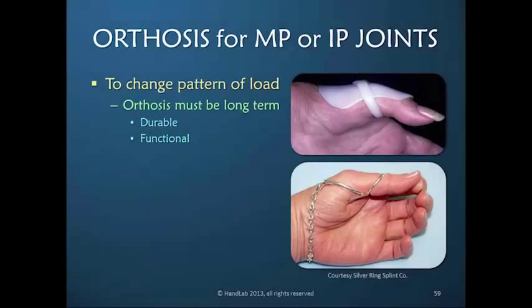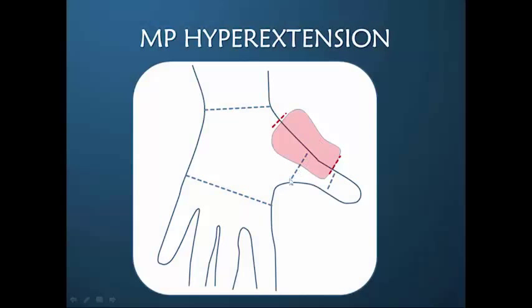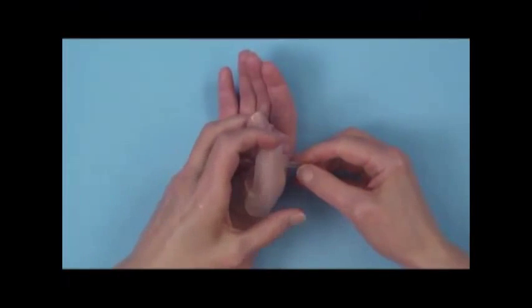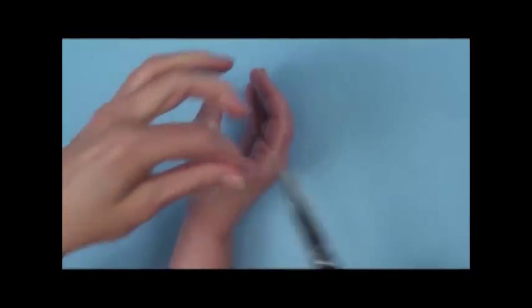Prevent motion in one direction but would still allow it in another. It is approximately one half of the circumference around the MP joint and the IP joint. It's important that this warm piece of tubing be completely dry when you adhere it to the dorsal piece.